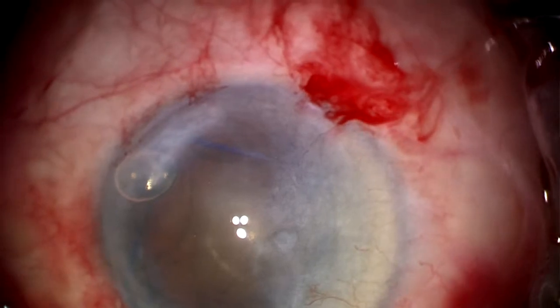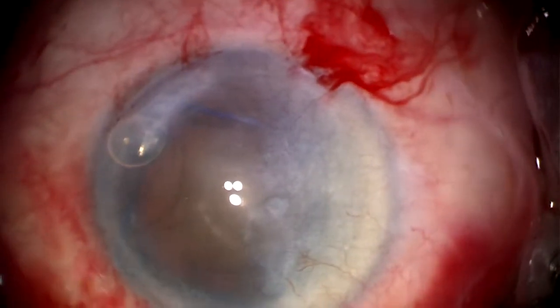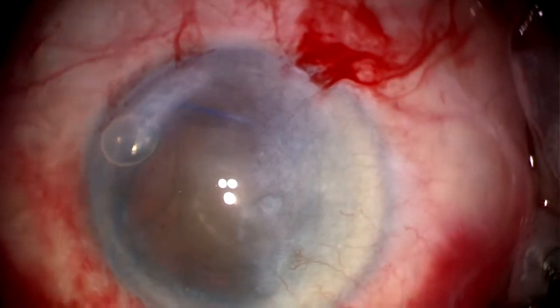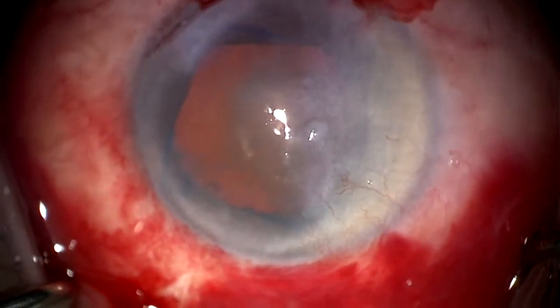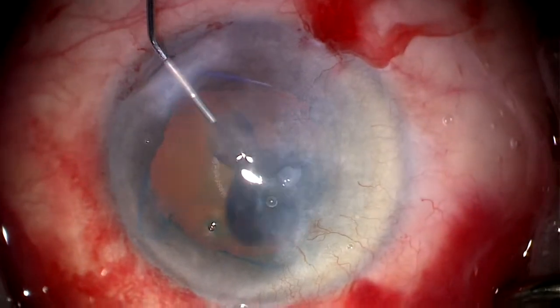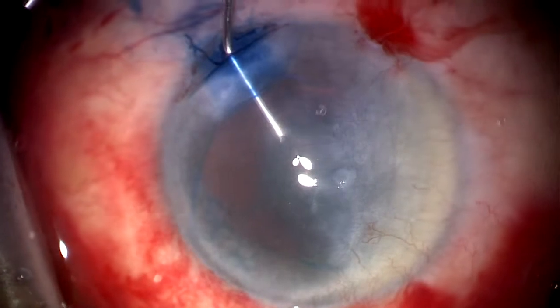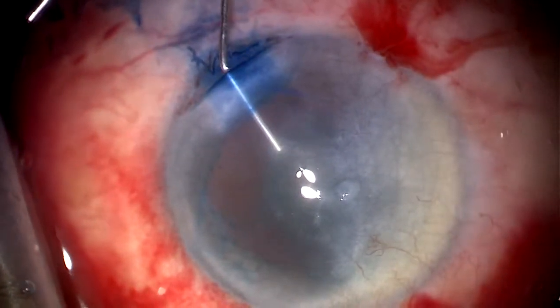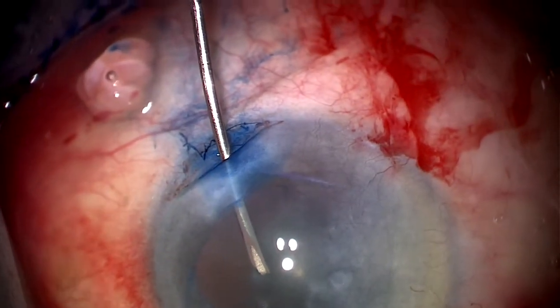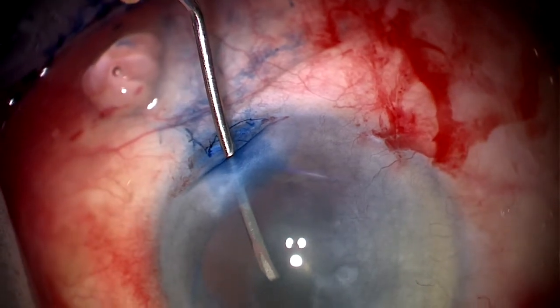At this point, it is noticeable that the red reflex is more apparent in the inferior half of the cornea, and this is the area we're going to use in order to carry out the procedure. I'm going to use some vision blue here to stain the anterior capsule, in this case where the view is compromised.